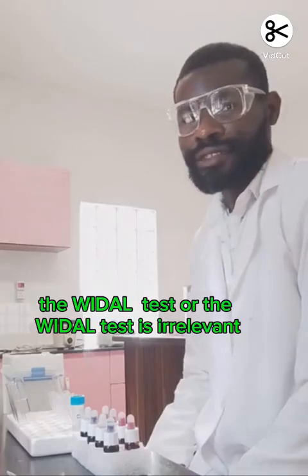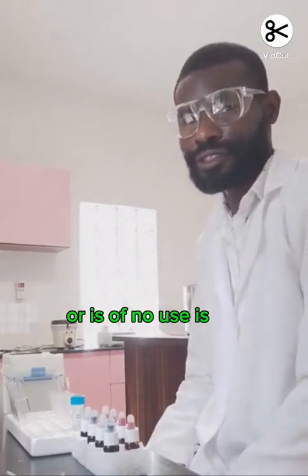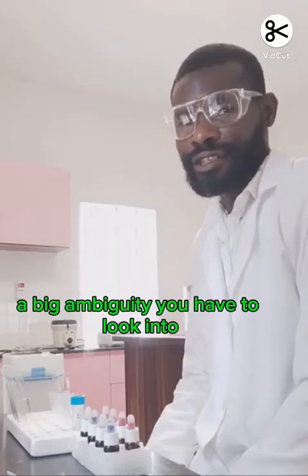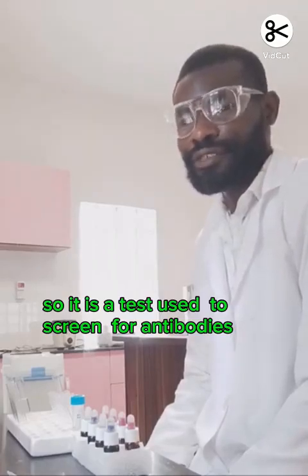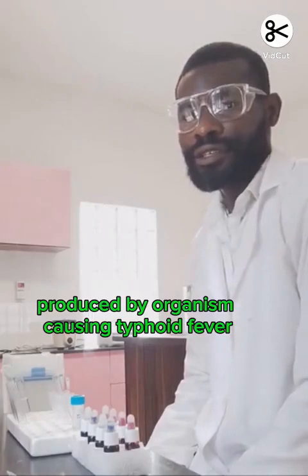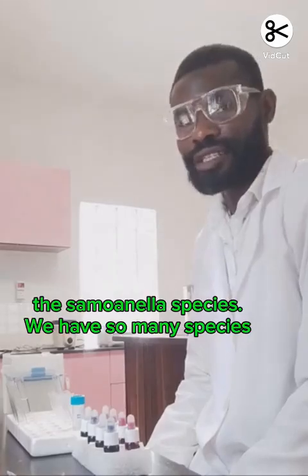To say that the Widal test is irrelevant or of no use is a very big ambiguity that you have to look into. It is a test you use to screen for antibodies produced by the organism causing typhoid fever, the Salmonella species.